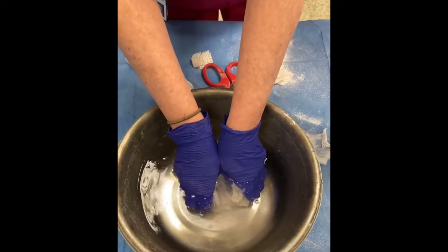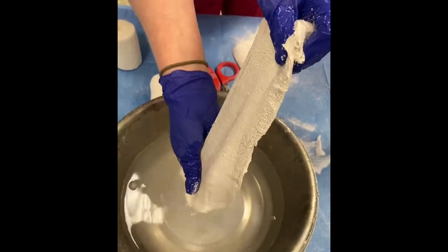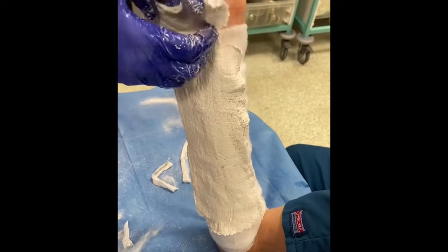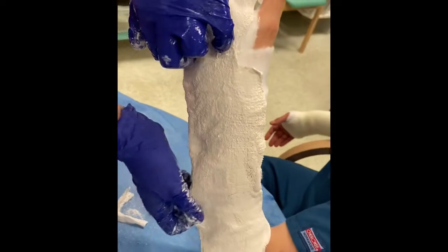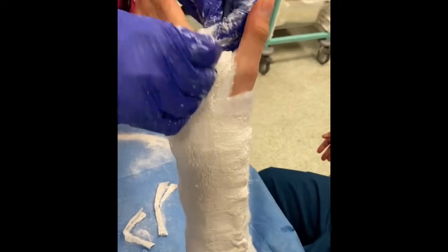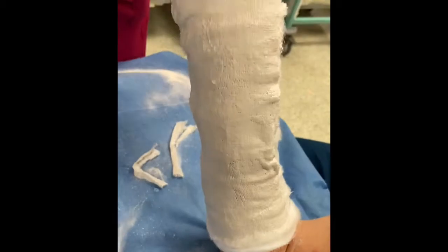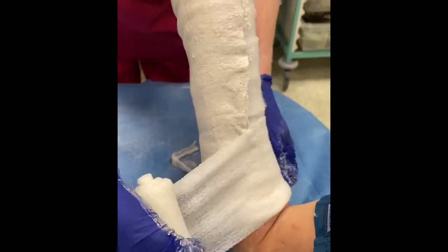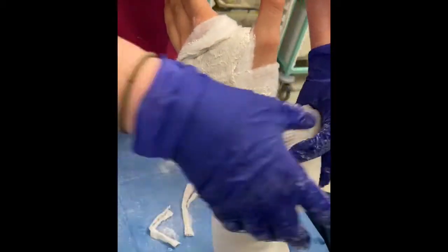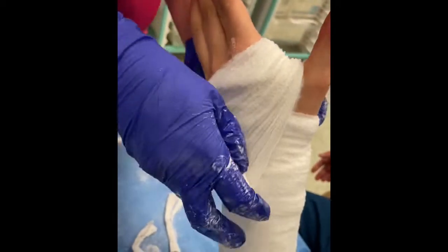The plaster of Paris is then dipped in lukewarm water for just a few seconds and the excess water is squeezed out. The plaster of Paris is then applied to the back of the forearm, taking care to position it as previously planned and to smooth it gently around all of the pressure points to make sure there is a good fit. The cast should come up to the level of the knuckles and no further. Once in place, the padding can be folded over the end — sometimes a tubinet stocking is placed on initially, which helps with this. The gauze bandage is then applied with just a little bit of tension to hold the whole cast in place. This is also the final opportunity to smooth the cast down and make sure that it fits properly.